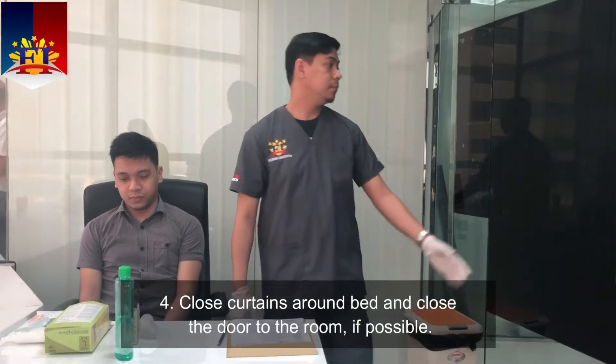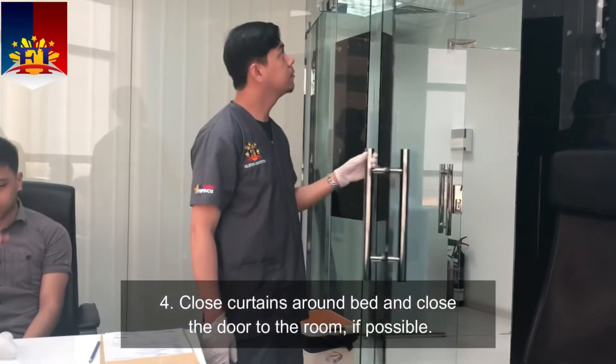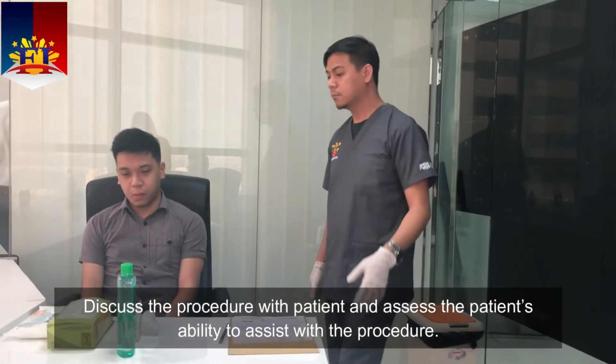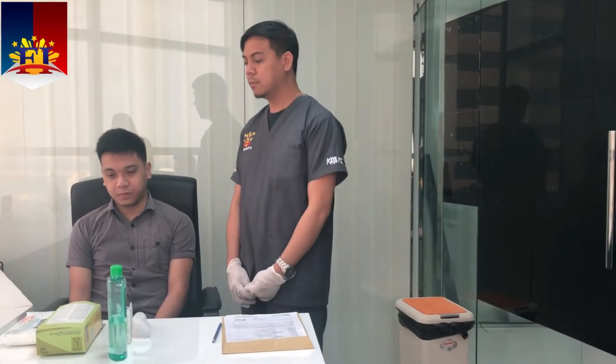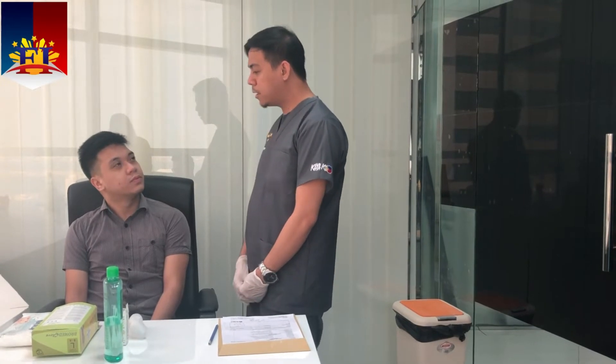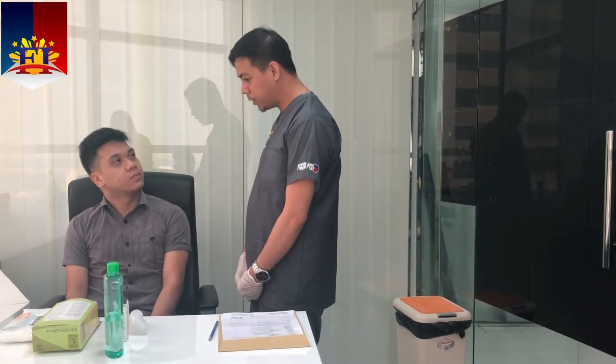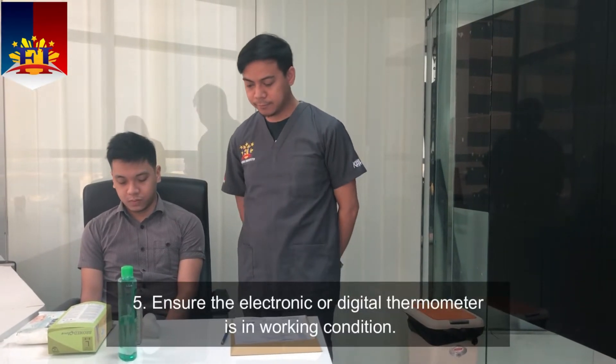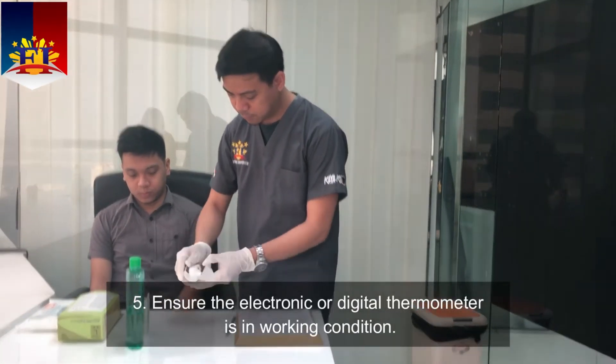Close curtains around the bed and close the door to the room if possible. Discuss the procedure with the patient and assess the patient's ability to assist. Sir, I will be doing a tympanic membrane temperature and will be obtaining it in a while. Ensure the electronic or digital thermometer is in working condition.